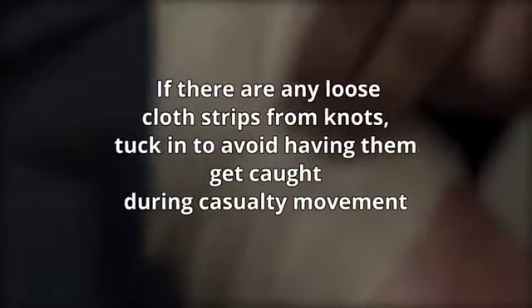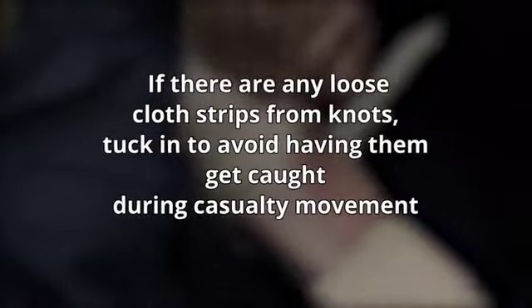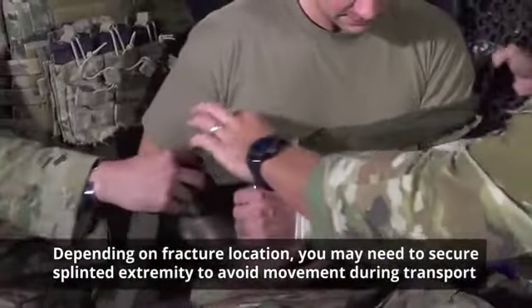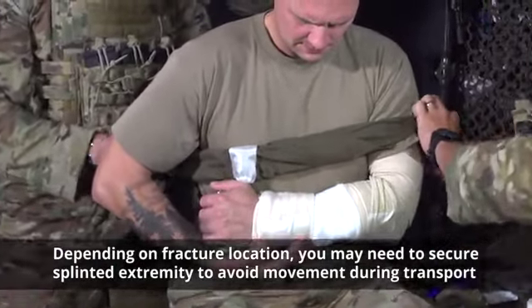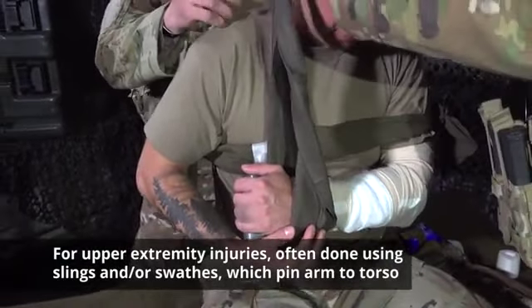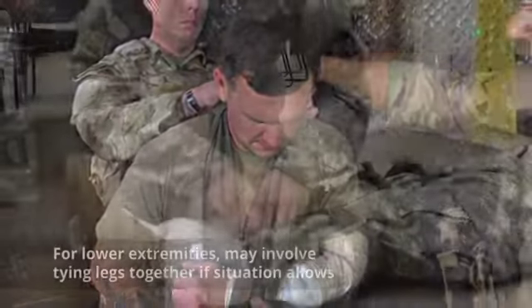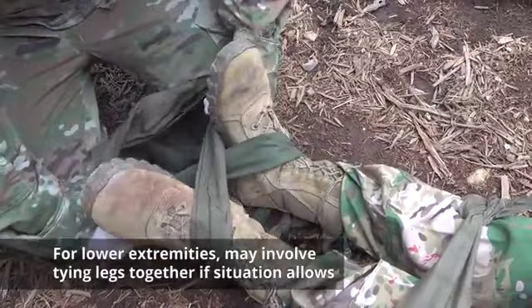If there are any loose cloth strips from the knots, tuck them in to avoid having them get caught during casualty movement. Depending on the fracture location, you may want or need to secure the splinted extremity to avoid movement during transport. For upper extremity injuries, this is often done using slings and/or swaths, which pin the arm to the torso. For lower extremities, it may involve tying the legs together if the situation allows.